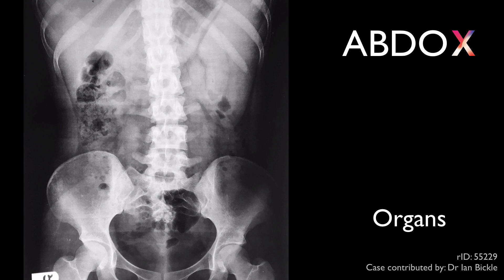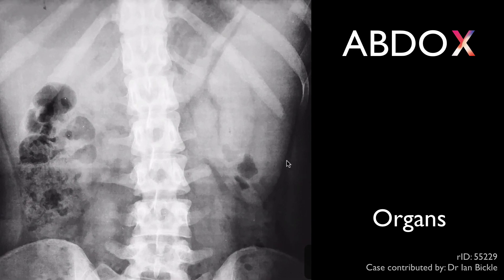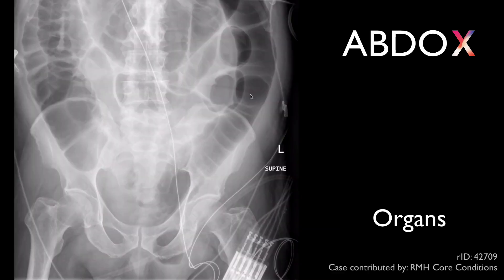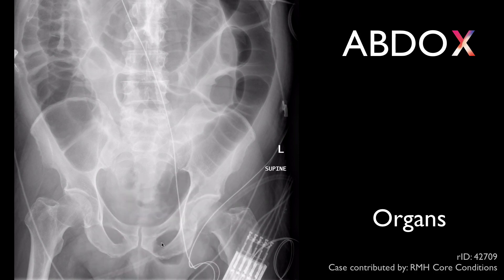O is for organs and soft tissues. The outline of the liver, kidneys, and spleen is usually visible, and organomegaly, such as this enlarged spleen, may be detected. Examine the lung bases and inguinal regions carefully. This gas in the left inguinal region indicates an inguinal hernia causing bowel obstruction.